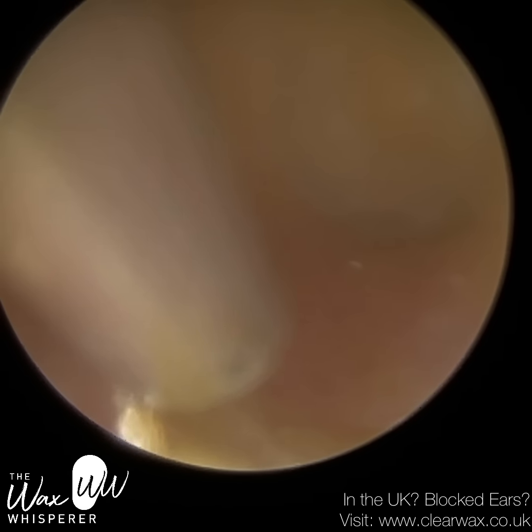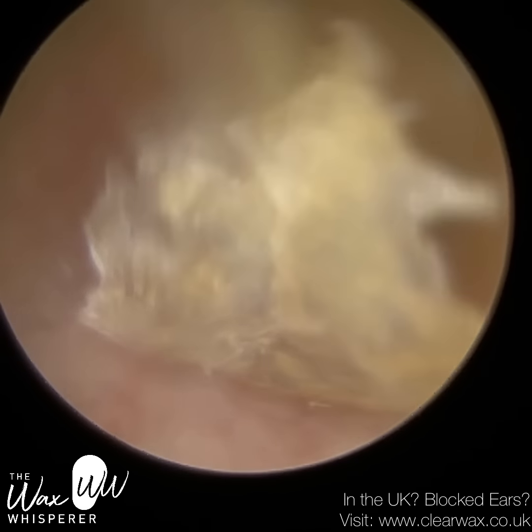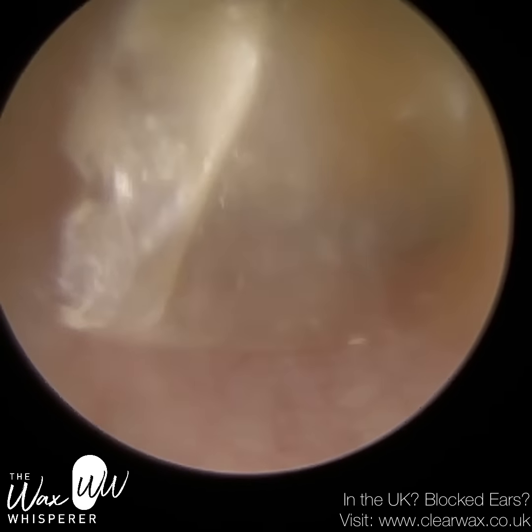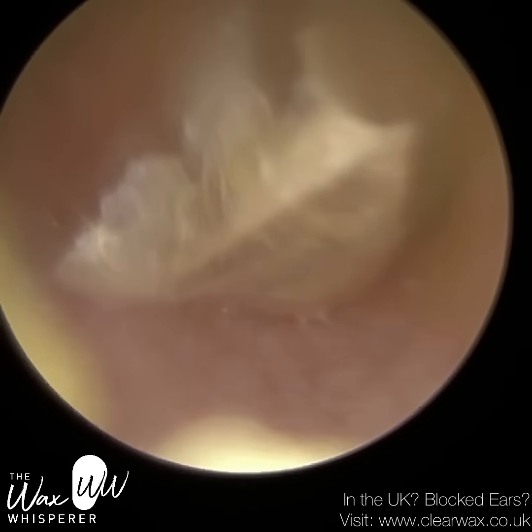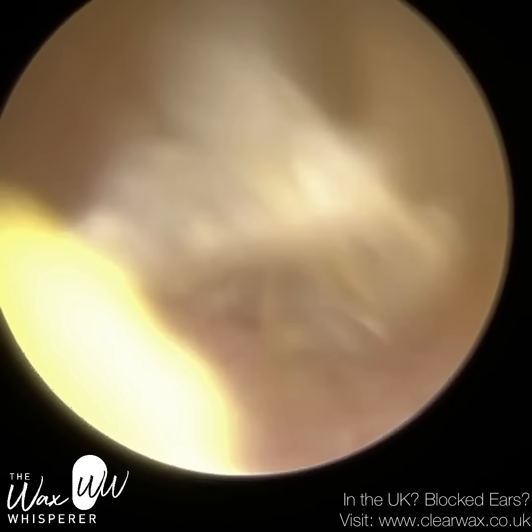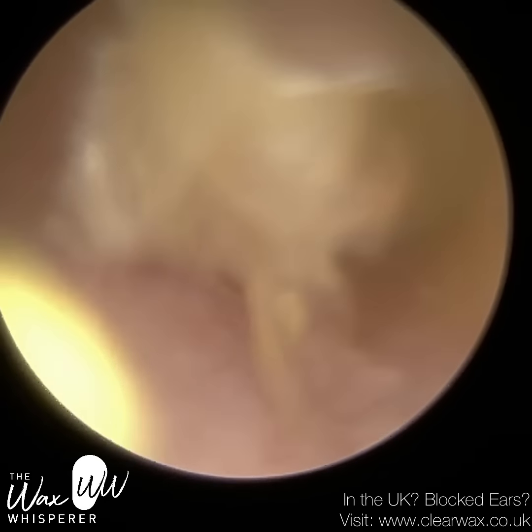Some of the skin tore off, so I'm just going to pick the skin back up. And then as I'm suctioning, I'm going up and away. You can see it's just loosening itself on the bottom, and I'm rocking it left to right, and that again helps to tear some of the skin.